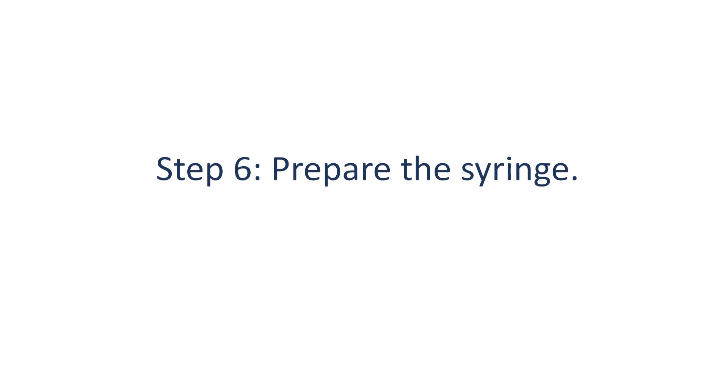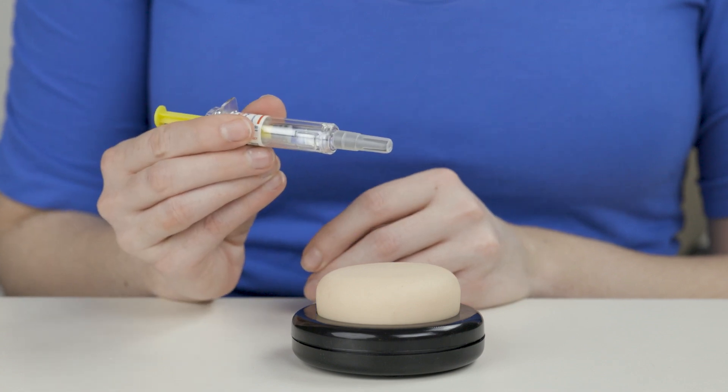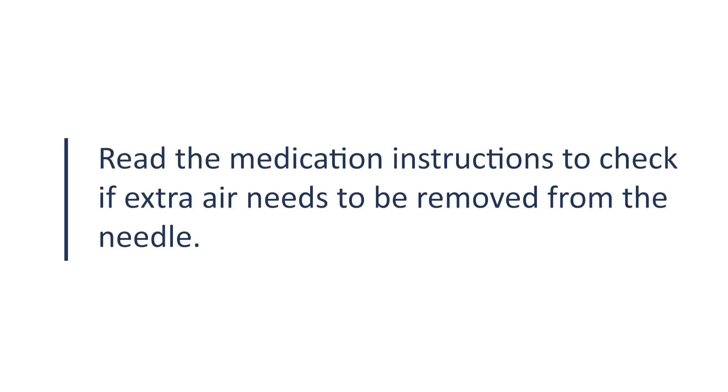Step 6: Prepare the syringe. Using your dominant hand — which is the hand that you write with — hold the syringe around the middle like a pen or dart. Read the medication instructions to check if extra air needs to be removed from the needle.